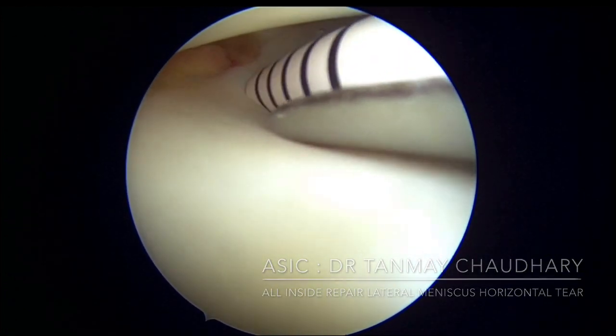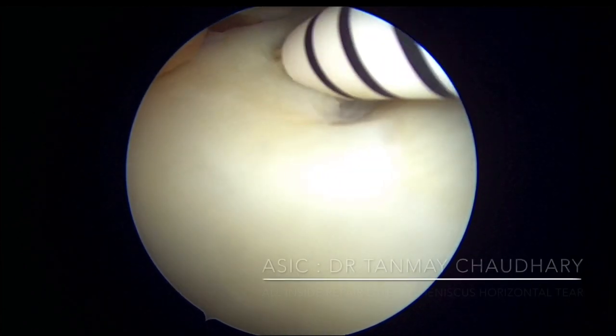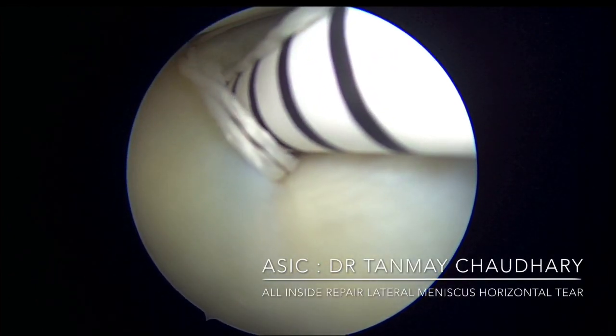Go for the superior flap or the inferior flap first, whichever you are comfortable with. Push in the anchor and then push on the knob to deliver the anchor outside the capsule. Take out and then replace in the inferior flap and push out the anchor again.